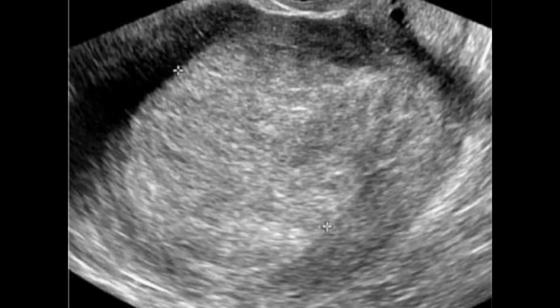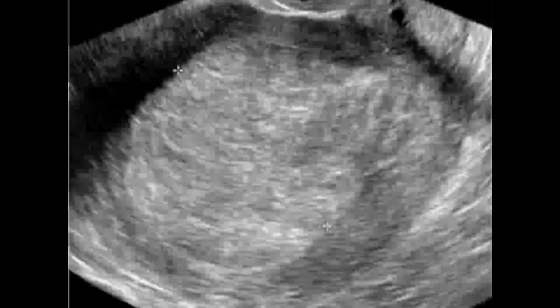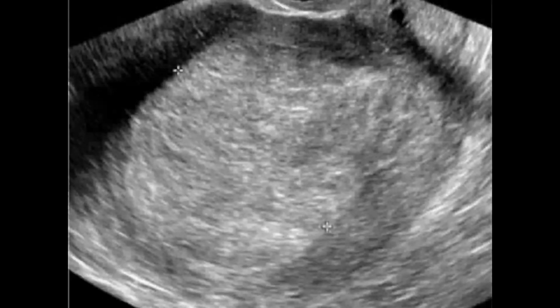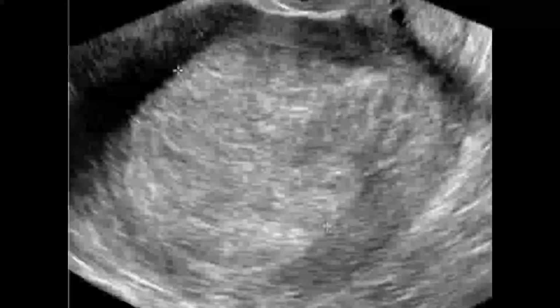Now this is the case for discussion. Here you can see this endometrium is highly proliferated. Besides this, there is a nodular formation and focal bulging as well. So you should keep a variety of differentials in consideration, but if clinical history is available, you may narrow down your differential. For example, the first and topmost may be endometrial polyp, and the second may be hyperplastic polyposis.